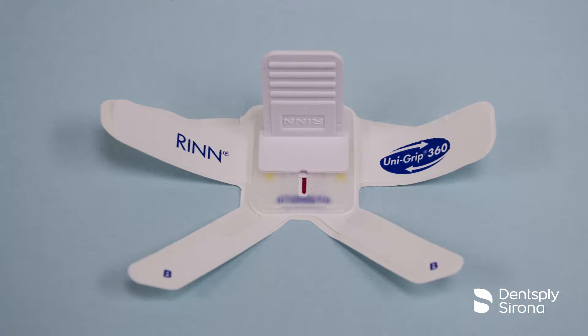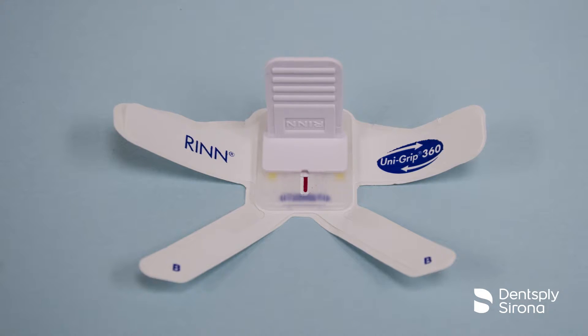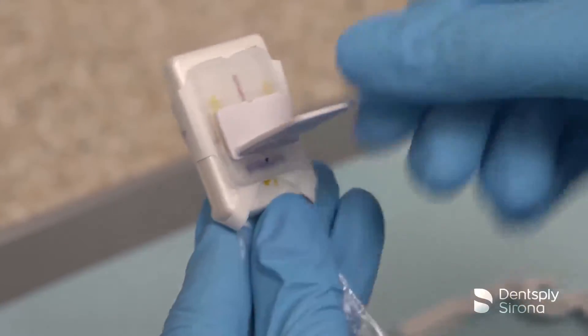The Unigrip Universal Sensor Holder is designed to provide an entire full mouth series using only one holder. This video will demonstrate the time-saving feature of the Unigrip 360 holder and its easy rotating tab.